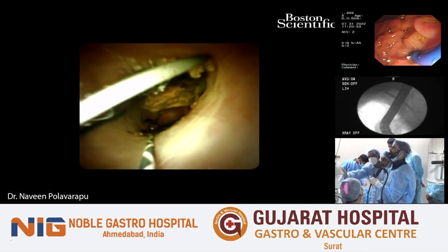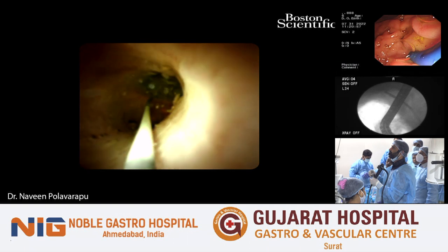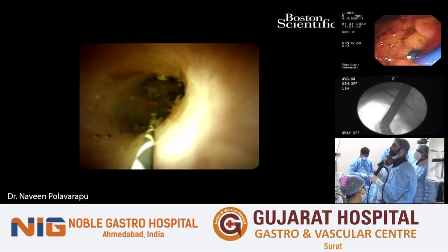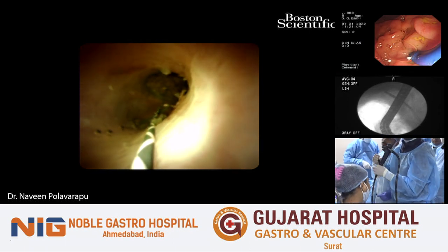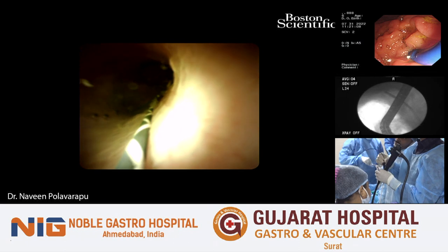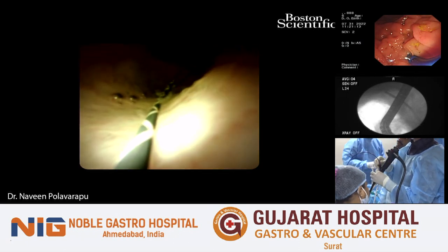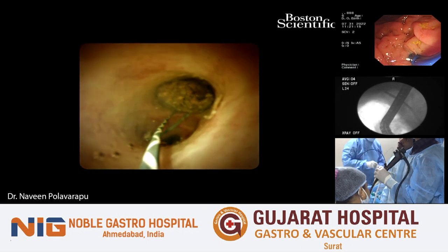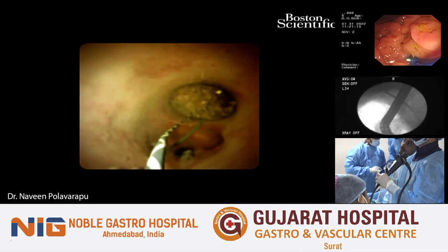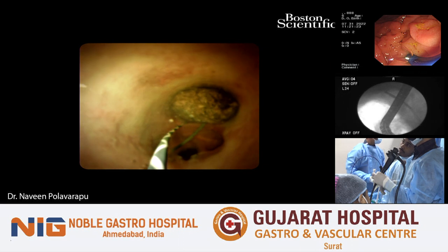I think you can appreciate the stone there better now. Yes, sir. I'm just straightening the wire a little bit. Okay, so that's where the hilum is, if you can see on the fluoroscopy. So there's one stone here. There may be another big stone. This probably should be able to get it. We can get rid of the stone with the balloon trawl, I would imagine. But anyway, because we are in the workshop, we'll try to break this stone.